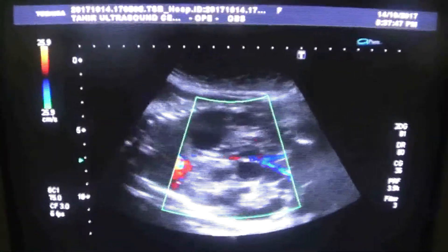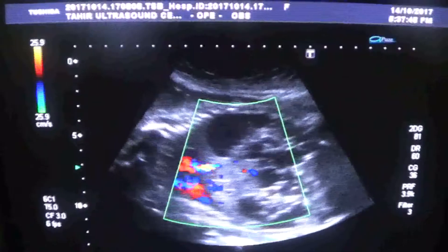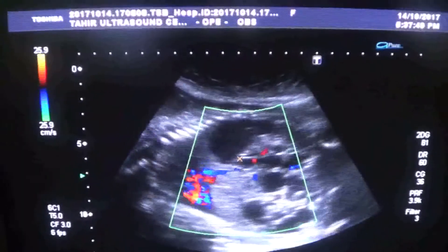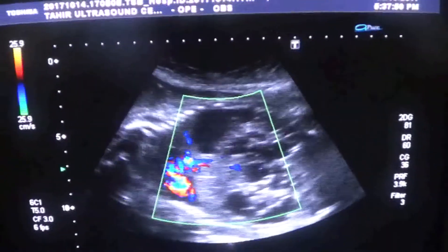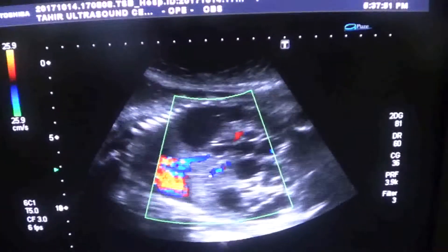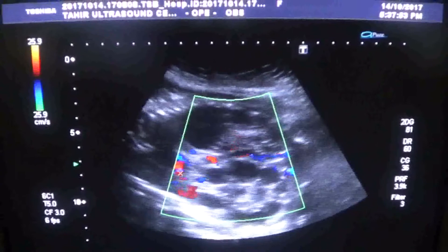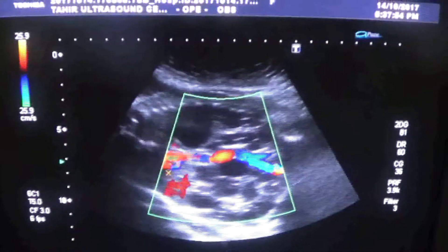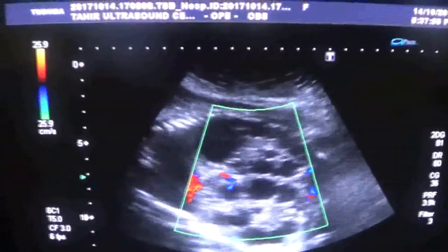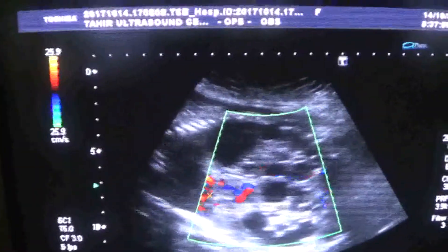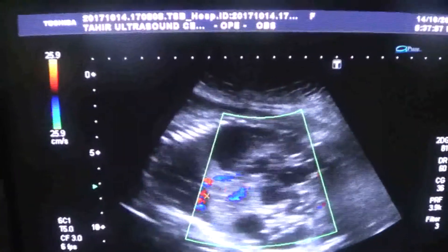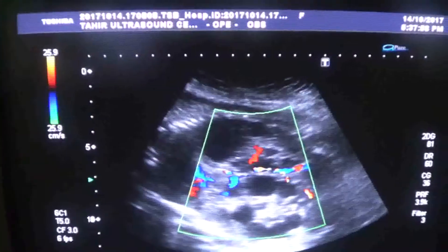Otherwise, this is the heart. So a short case study of multicystic dysplastic kidney. Thank you.